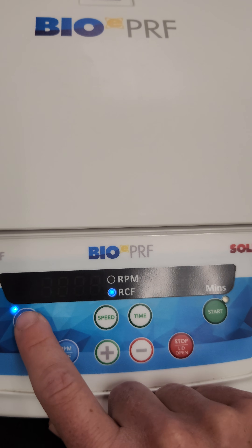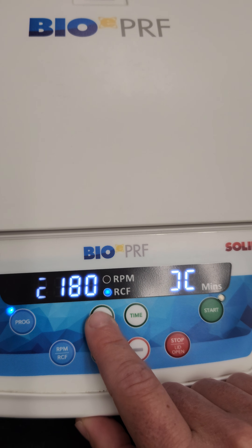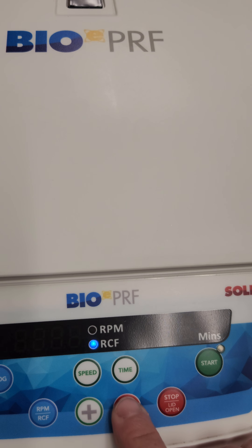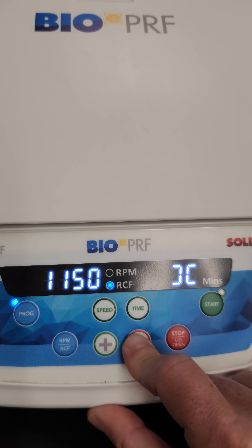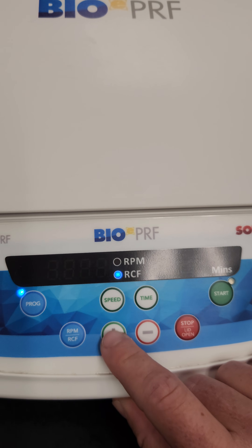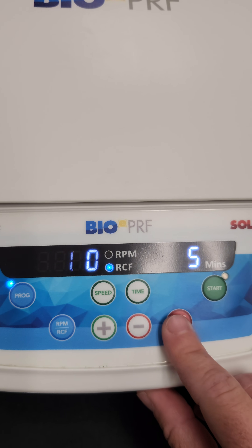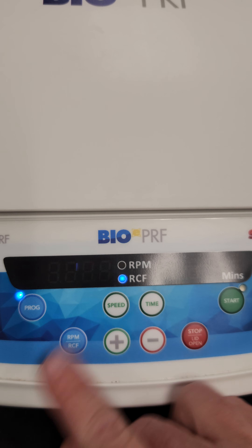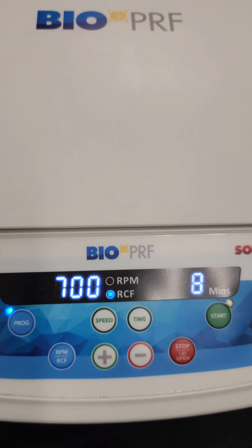Lastly, let's do a third program — 300 for five minutes. So now we're set. You can just switch back easily throughout the programs and now it's already going to be set. Whatever program we want, we can just hit start and then you're good to go.